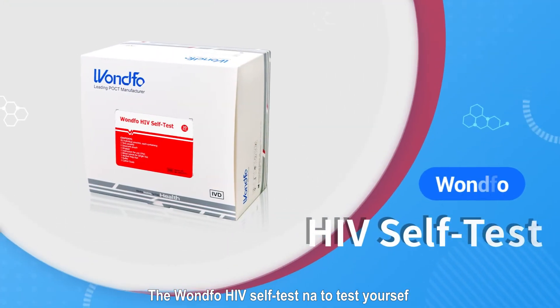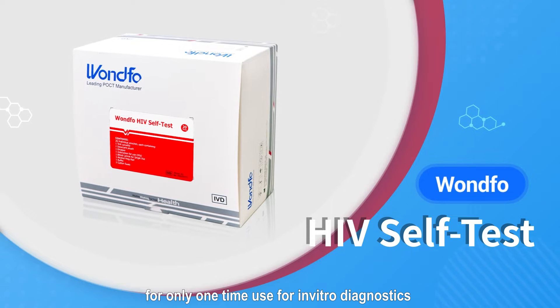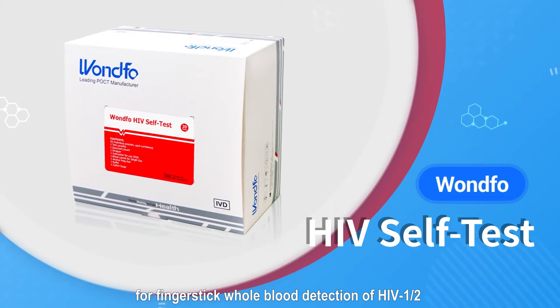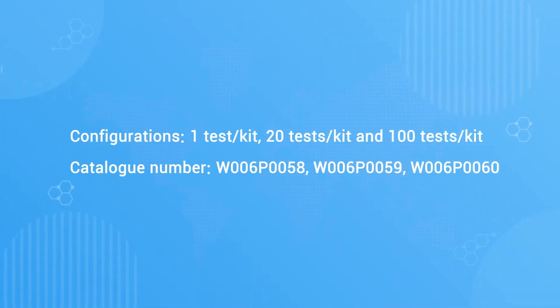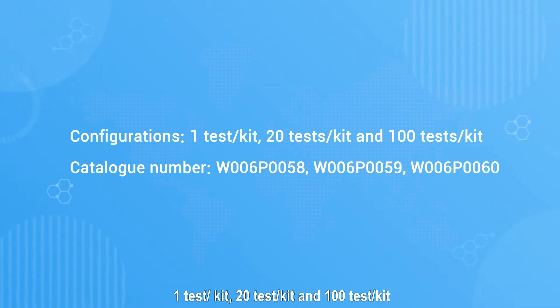The Wondfo HIV Self-Test is a single-use in vitro diagnostic self-test for fingerstick whole blood detection of HIV 1 or 2. There are three configurations of the test kits: 1 test per kit, 20 tests per kit, and 100 tests per kit.